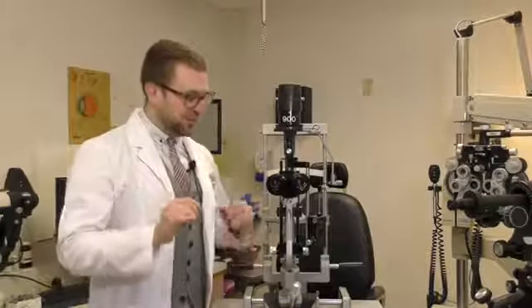Don't worry about it. I know it looks a little bit complicated with a lot of different dials and buttons, but I'm going to simplify it and show you exactly what you need to know to get a good view of the eye and to examine all the ocular structures.